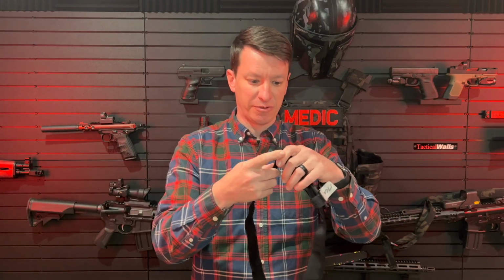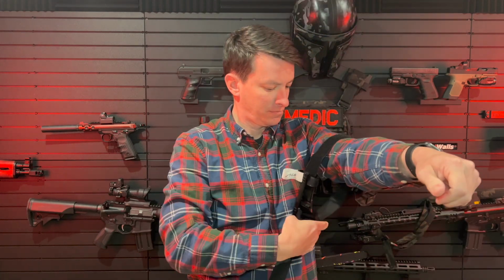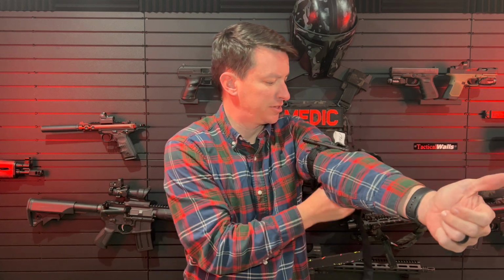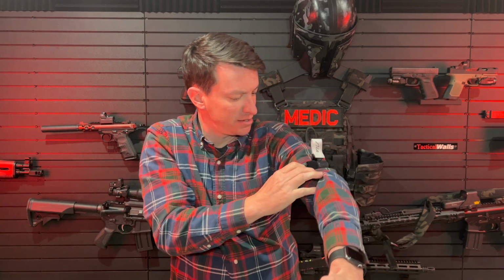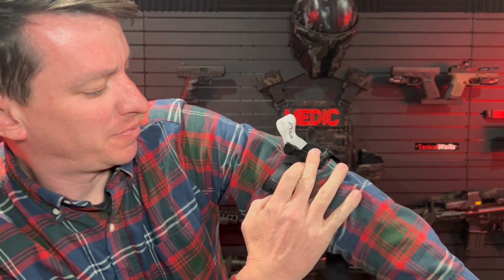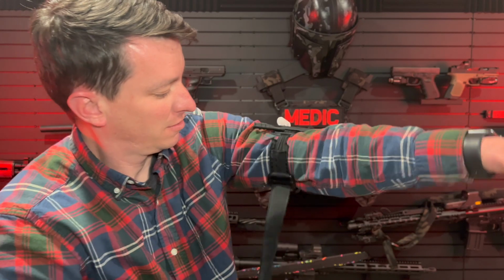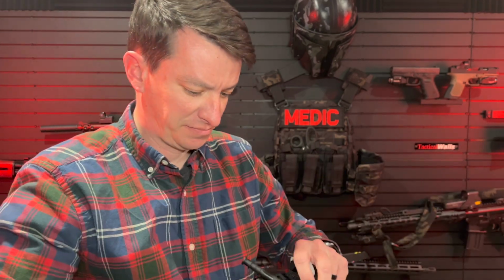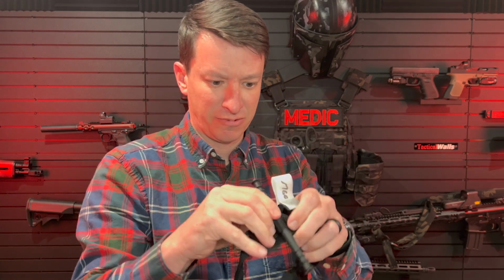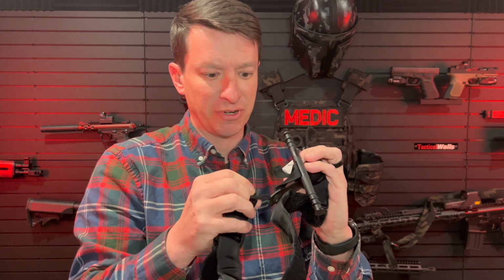All right, so we'll test it out. This is the fake one here. Make sure I got it straight. There we go. Pull it tight. And look at that, it is ripping as I turn it. Let's see. Oh, it ripped right there. The understitching, you can see where it's pulling through and ripping right there. So, tighten it up, and you can see the stitching rips just as I was trying to tighten it up. So, there you go. Just ripped apart.